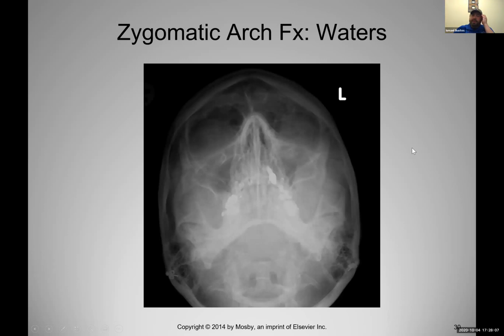All right, so for this one here, where do you think the fracture is of the zygomatic arches? There is one, and which one do you think it is? You think it's on the right side or left side? Look at it very carefully. It's Waters projection.